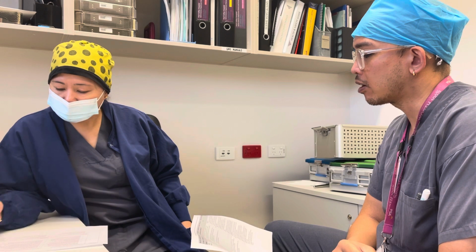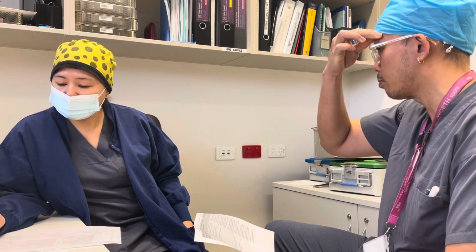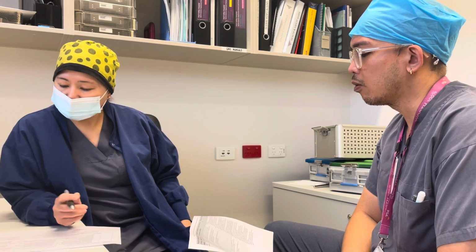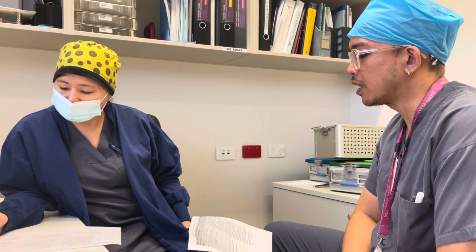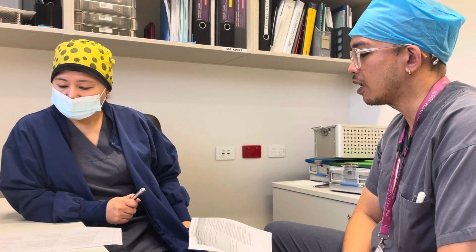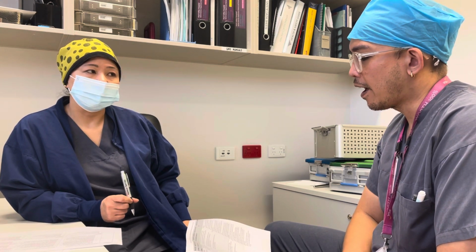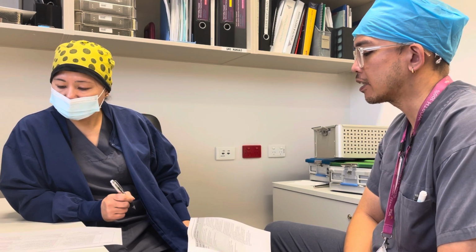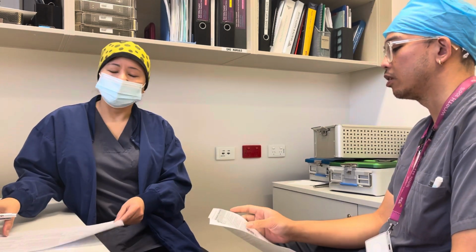The standard is suitable for medical, dental, and allied health facilities, as well as skin penetration establishments like tattooists and certain cosmetic facilities. It does not apply to day surgical or day procedure centers, where 4187 would be applied. It doesn't apply to the reprocessing of items intended by the manufacturer for single use. Similarly to 4187, it doesn't apply to items that are contaminated or may be contaminated with TSEs such as CJD. It does not sufficiently apply to workplaces that undertake complex patient procedures and sterilizing processes, where 4187 would again apply to here.